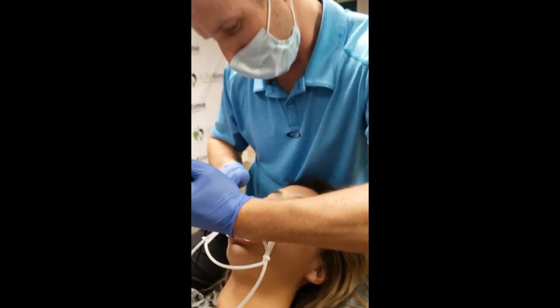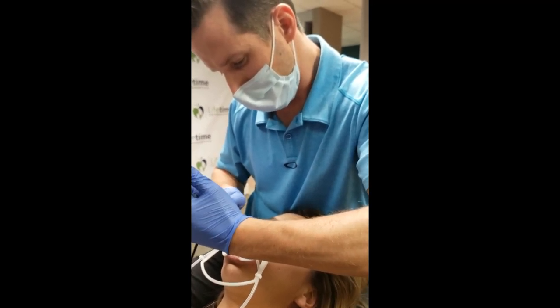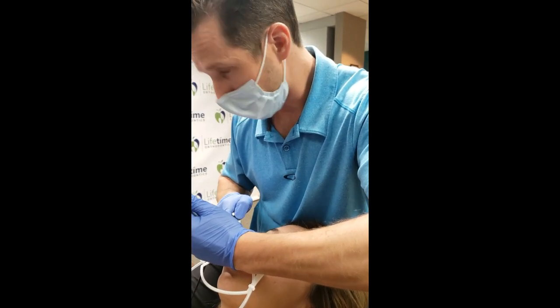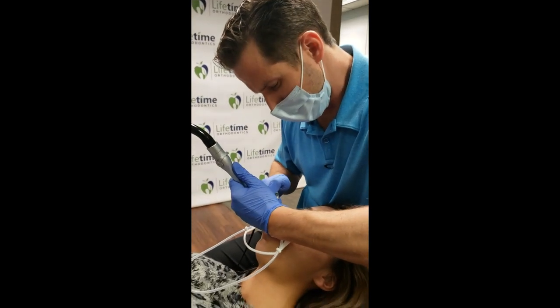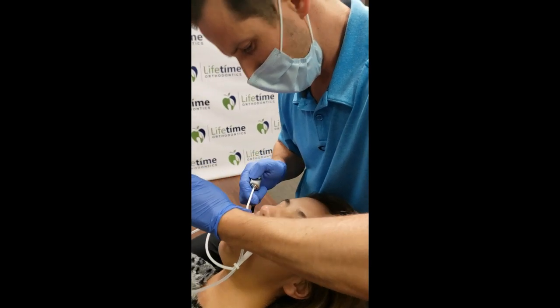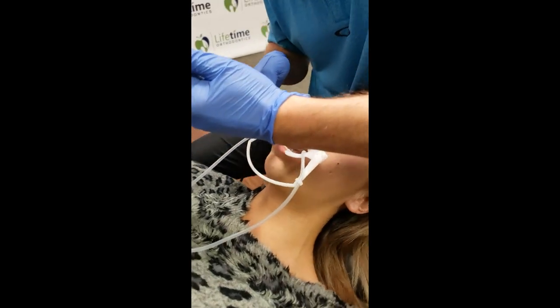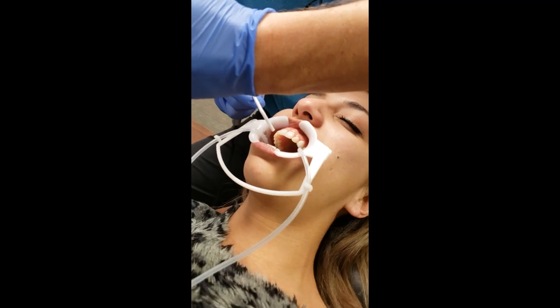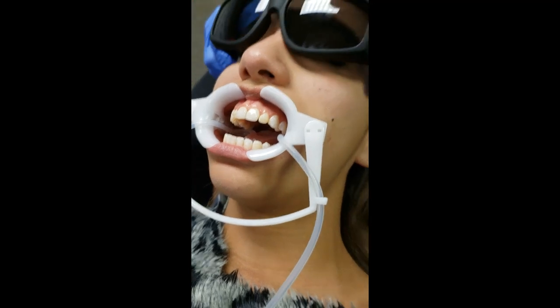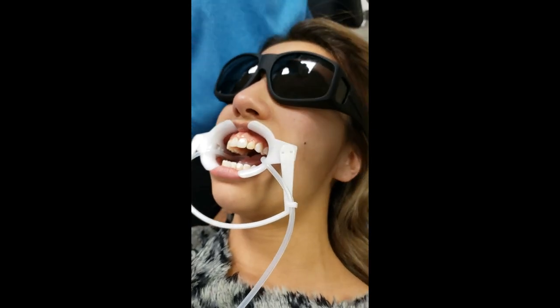One major thing we almost forgot - this is my fault - is that anytime we're using any chemicals or high speed, we need to have safety glasses on. Everything's looking nice and chalky, so we're going to go ahead and paint all the surfaces.